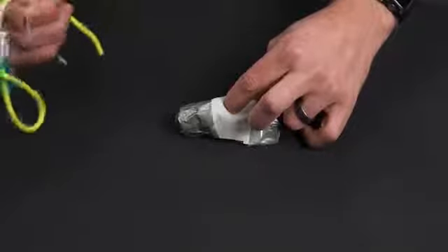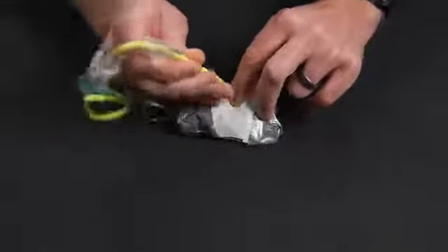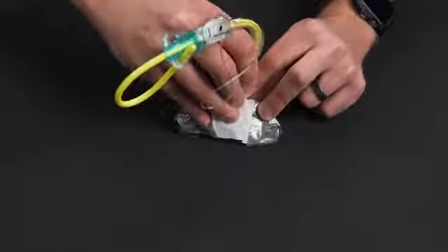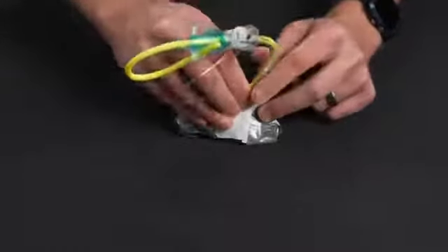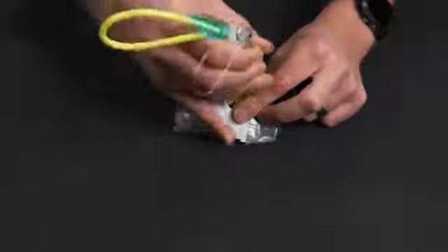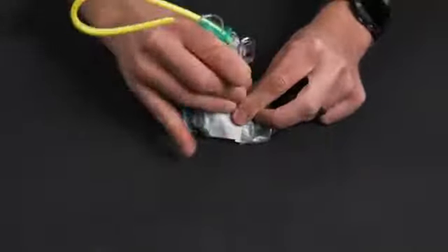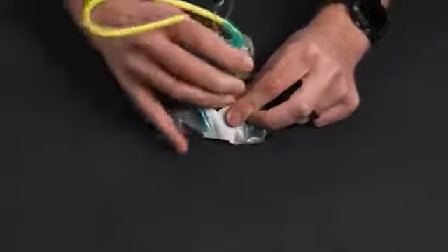I'm then going to take my tube with the bougie introducer. I'm going to slide that in beside my finger, hopefully feeling those tracheal rings with the coude tip. And we're going to once again insert until we can't go any farther because it hit the carina, and then insert the tube after it.